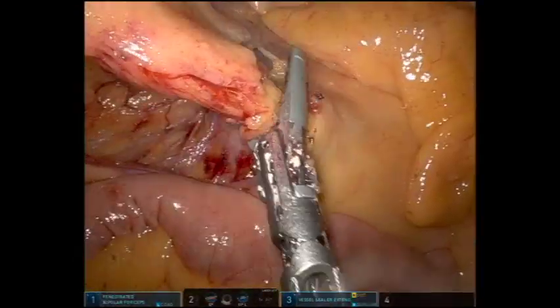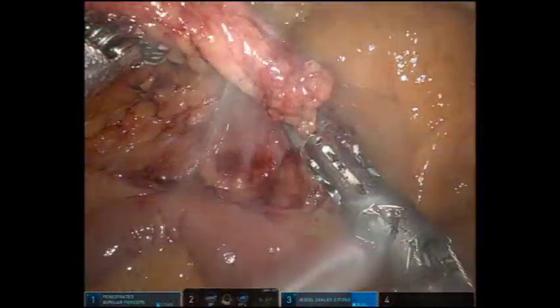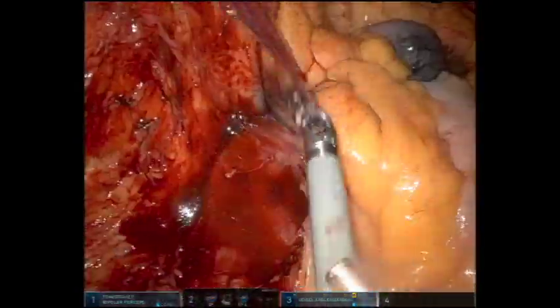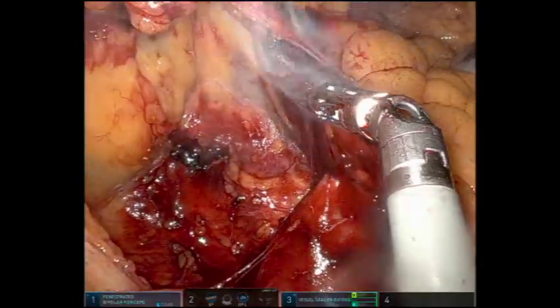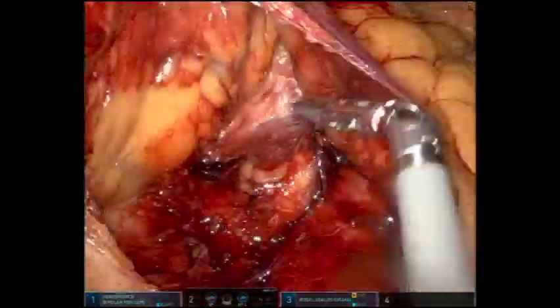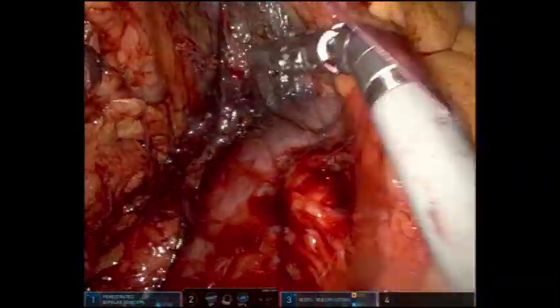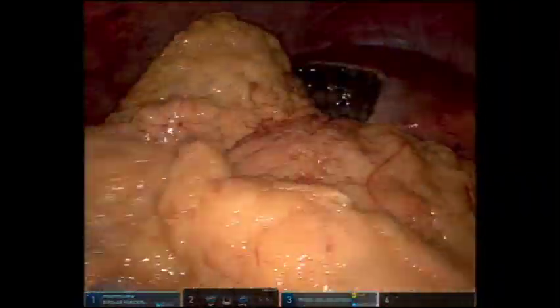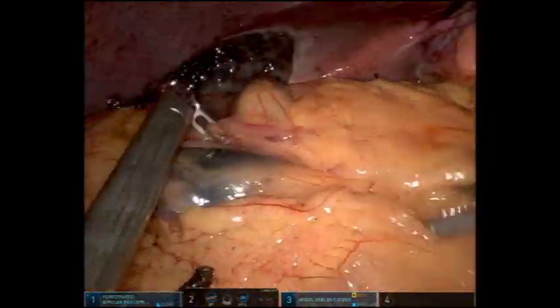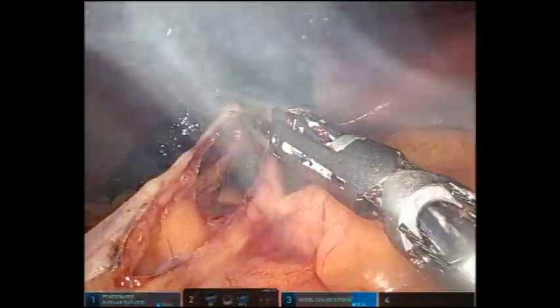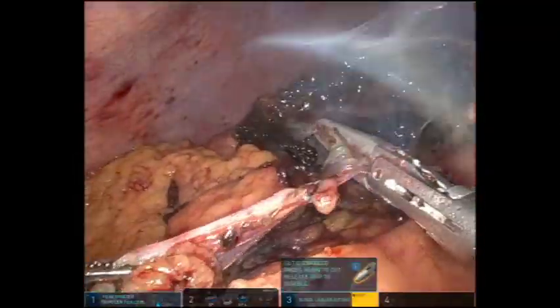The ileocolic vessels are ligated at their origin using the vessel sealer. The remaining attachments around the duodenum and the right kidney are taken down. The medial-to-lateral dissection had been completed across the hepatic flexure. The omentum is brought down exposing the gastrocolic ligament, and the lesser sac is opened using the vessel sealer, where the previous dissection is encountered immediately.